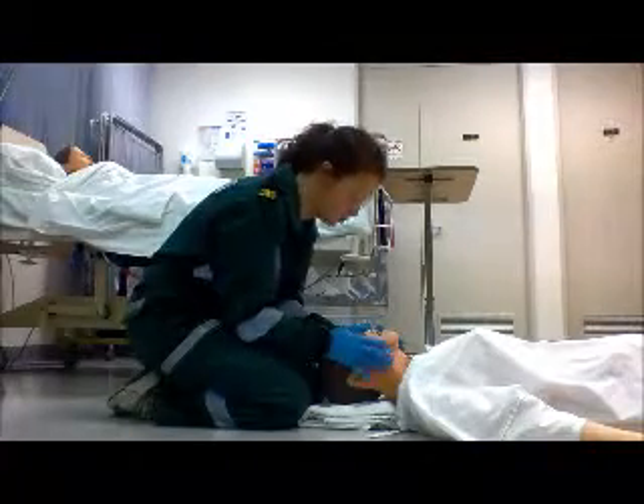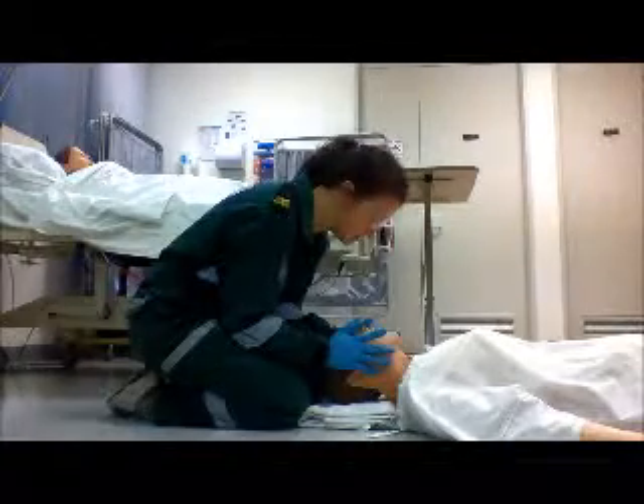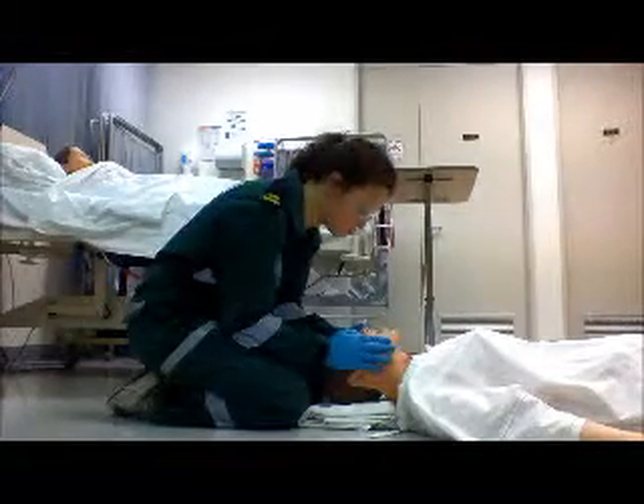And then to do the jaw thrust, you have your fifth, fourth, and third fingers on the edge of the mandible, and your index finger and thumb on the zygomas, and gently thrust the jaw forward.